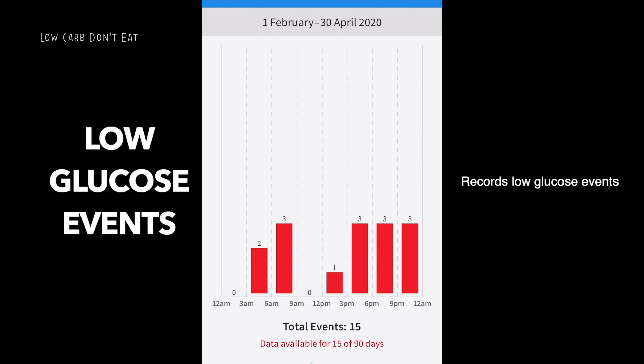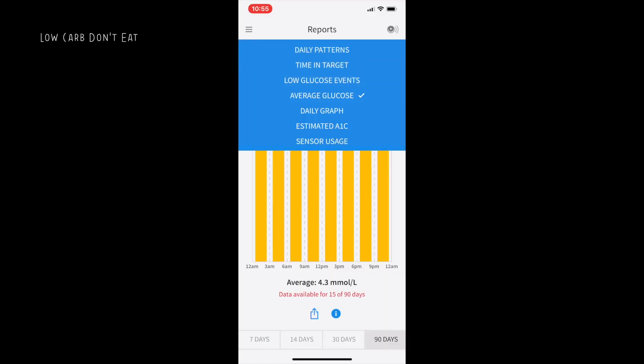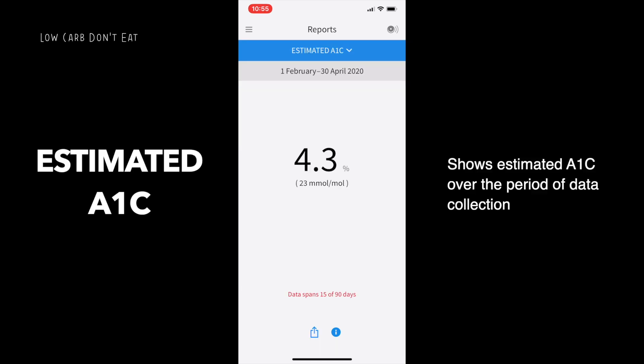If you have high ranges, it will also indicate that you're spending most time at the higher end. Low glucose events shows how many times your glucose dipped below recommended levels — useful for tracking. Average glucose is helpful to confirm you've been maintaining levels well without huge differences. Estimated A1C is the hemoglobin A1C reading — normally requiring three months of blood data, but here the app collates 14 days of information to give an indication of your average glucose and whether you need to take steps to reduce it.